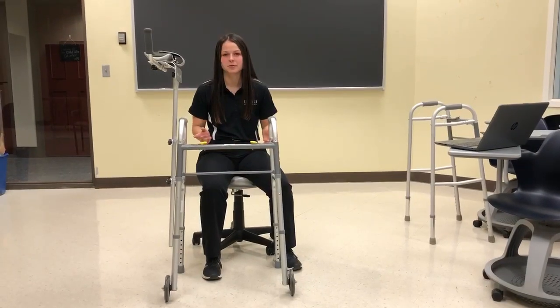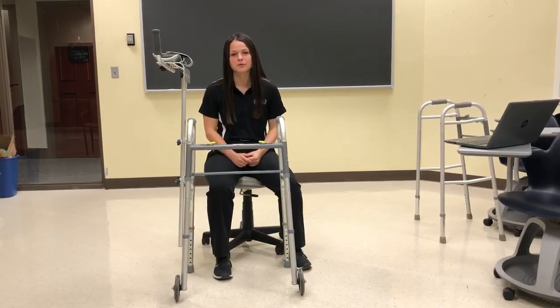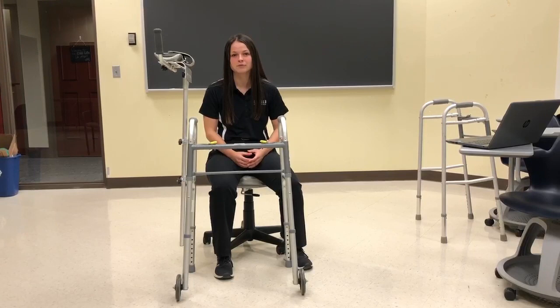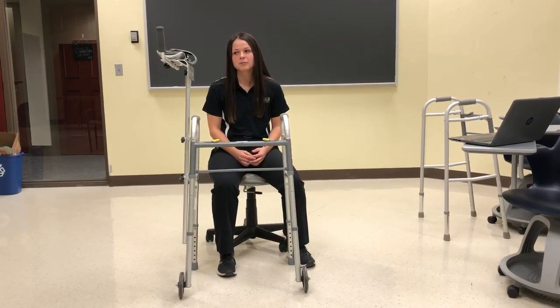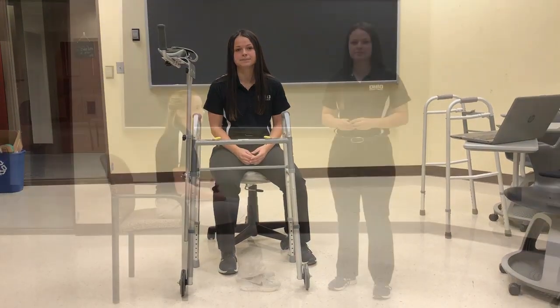Lastly, we have the platform walker. This walker has a platform at one's chest height that allows them to bear weight on their forearms rather than their hands. This walker is typically used for patients who have trouble bearing weight on their hands, as well as those with neurological disabilities. However, because of its platform, it's bulkier and more difficult to collapse.